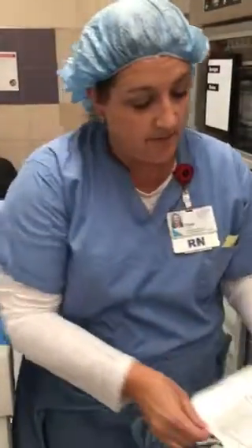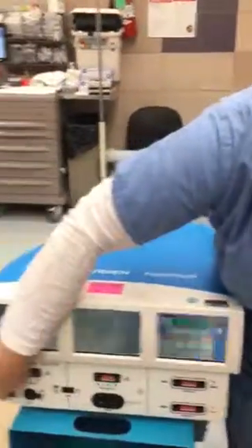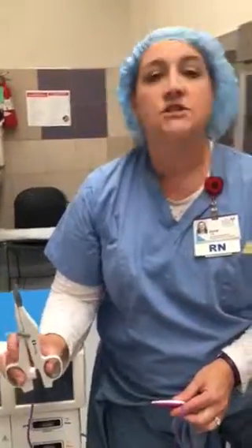Once the case is done, you would remove it from here, turn the machine off, and then this is disposable. It's a one-time single use. It just gets pitched into the trash.